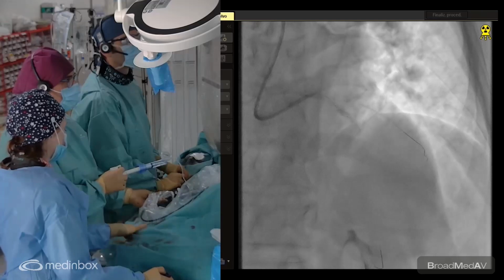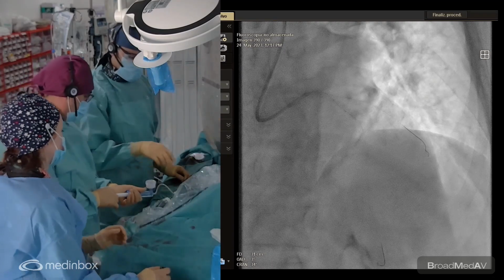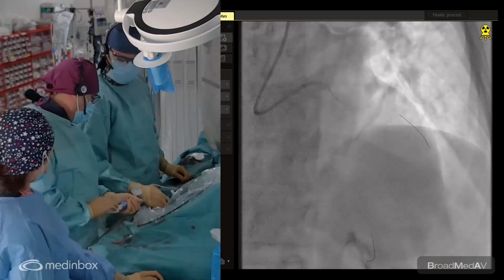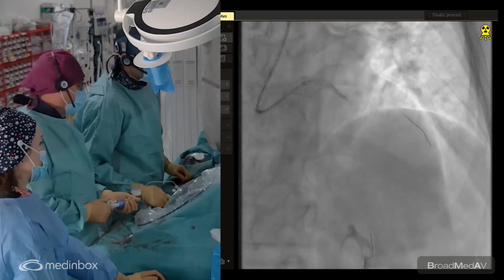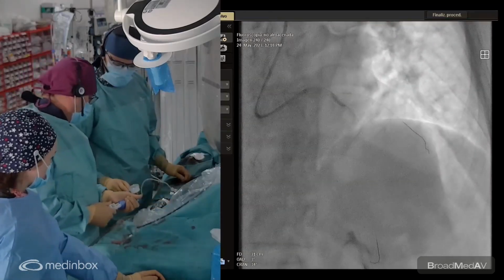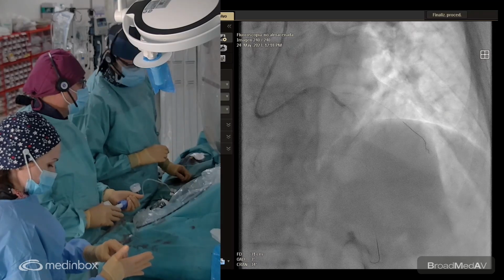Test, please, Patty. It's almost occlusive, I think, there. So we have to connect the yellow light. Okay, so we are going to inflate to 4 atmospheres. And then, when the balloon is inflated, 4, I'm going to press this button to apply the pulses. You can see a countdown in the console in the generator. And after that, 10, okay, we go up to 6 atmospheres and maintain inflated until a sound is heard.